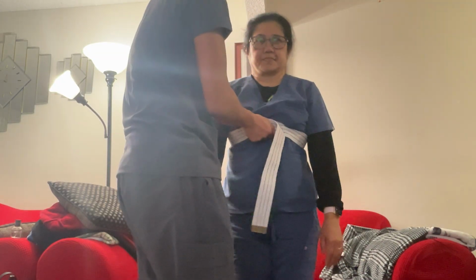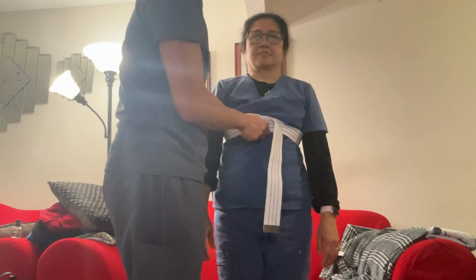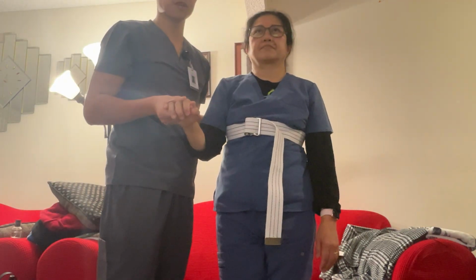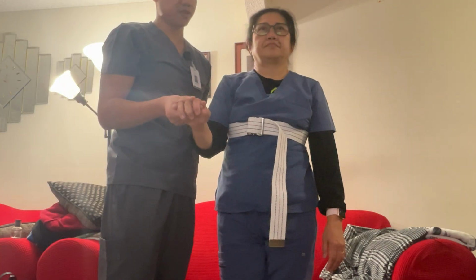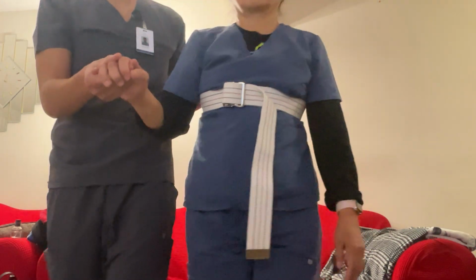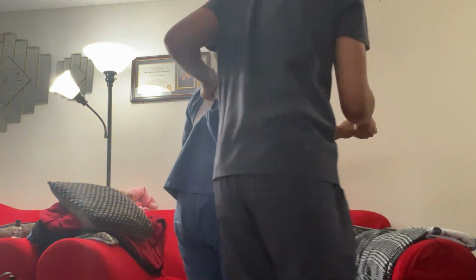We're up. Do you feel any dizziness, nausea? No. Okay. Now I'll be supporting the patient from their weak side, which is the right side. I'll take their hand. And can you please face forward, just so that there's no obstacles, anything? All right. Now that the patient is facing forward, we'll be able to walk now. So we'll just take steps at your pace. 1, 2, 3. Now we'll turn around. Okay, 1, 2, 3. Turn around again.